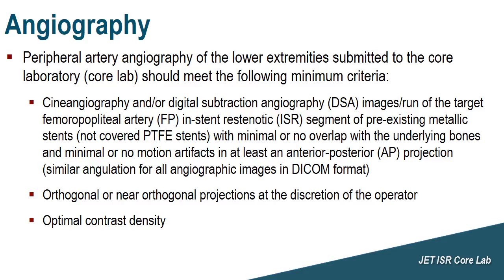Regarding peripheral angiography, cine angiography, or DSA, digital subtraction angiography, image runs of the target femoropopliteal in-stent restenotic segment of pre-existing metallic, however not covered PTFE, stents are included in the study, and therefore there should be no or minimal overlap with underlying bones when these images are captured, and also minimal or no motion artifact, in an anterior-posterior projection.